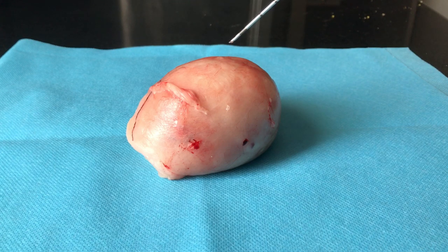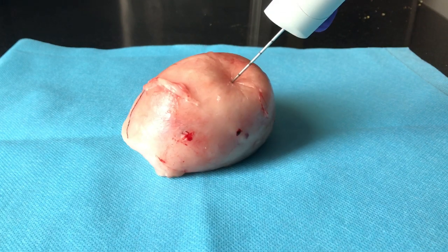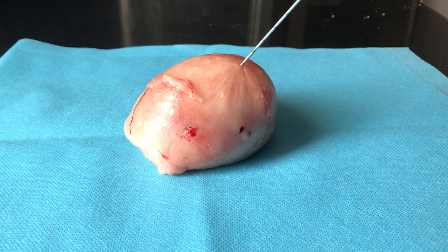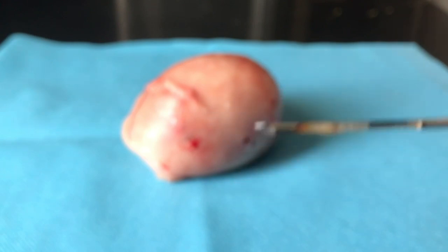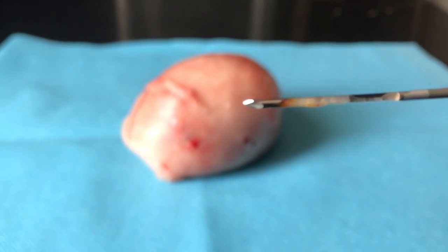I am just repeating the steps I have mentioned before. If you want to be an expert, you need to practice it over and over again to get hands-on practice. Here again you can see the small amount of tissue that has been excised from the tumour sample.